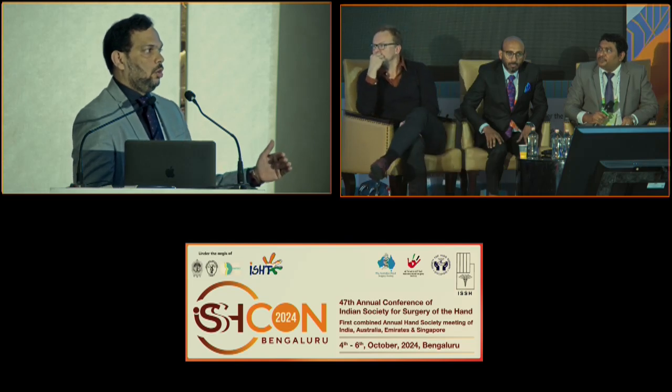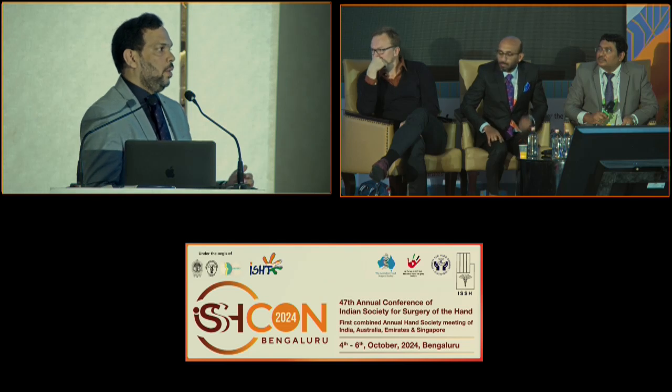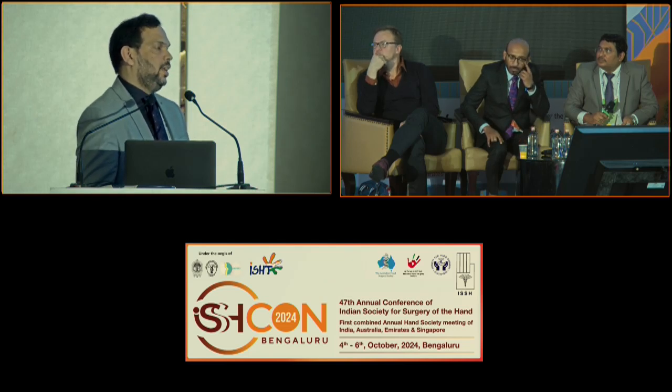But for 2 mm resection, I wouldn't do it for significantly positive variants. It's hardly 2 mm or less, because ulnar shortening looks like too much for that, when just 1 or 2 mm of resection is needed. And like you said, there is always some amount of bone left because we can't go to the extremes on the volar or dorsal side, but that sufficiently decompresses the central part, which is the pathological part for the patient.